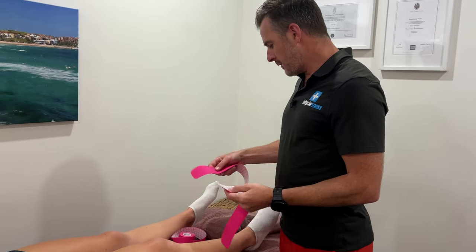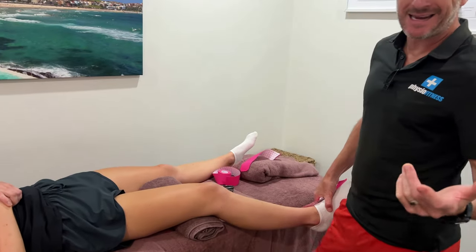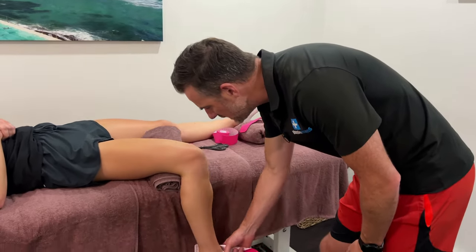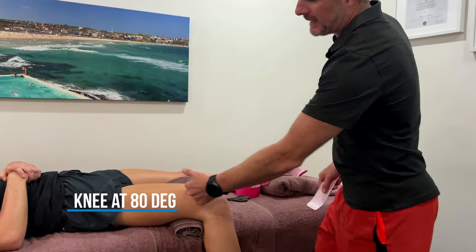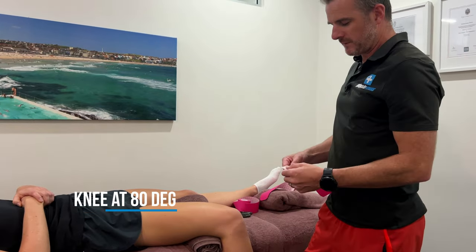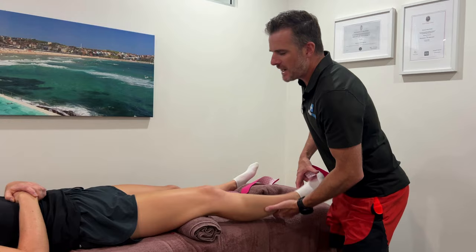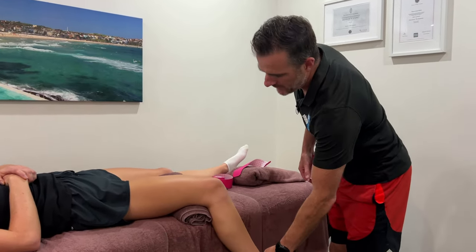With this tape, I want to apply it with the quadriceps at length. So the best thing to do is pop that leg off the side of the bed — about 80 degrees or so — so the quad is now lengthened. We want a bit of length because they've got a bend in the knee. If you do it straight and the tape is tight, as soon as they bend the knee it's just going to rip the tape off. Give them a little bit of flexion — it doesn't have to be full flexion, about halfway.